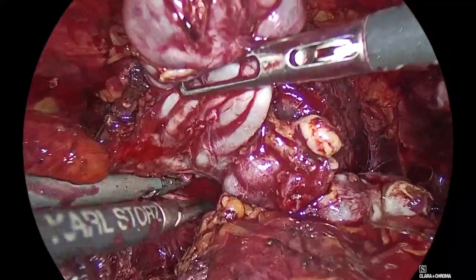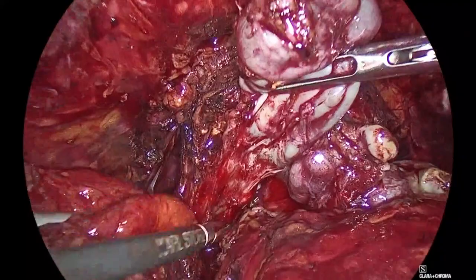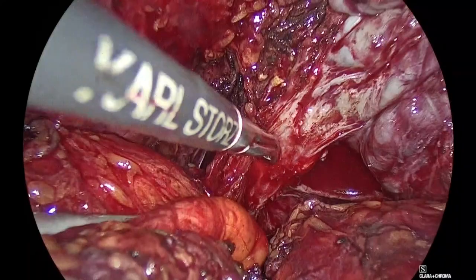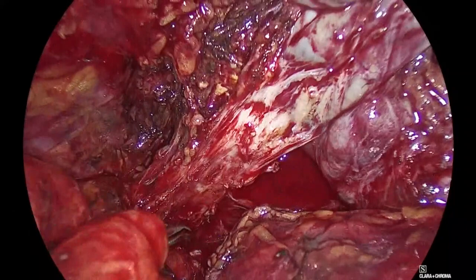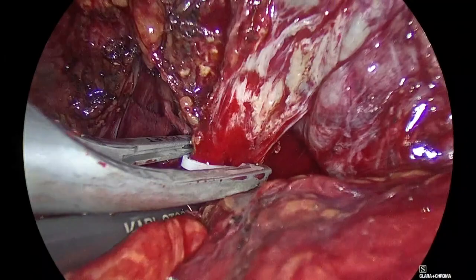Very nice. Good. Aspirate in there, please, Panagiotis. Good. Clip, please. Let's see if it takes everything, Panagiotis. It's a purple one. It's quite thick tissue, but let's see if it's good. In fact, it's good. Scissors.